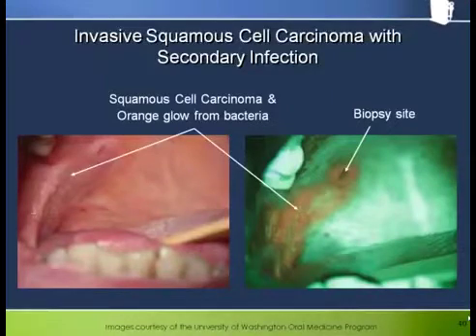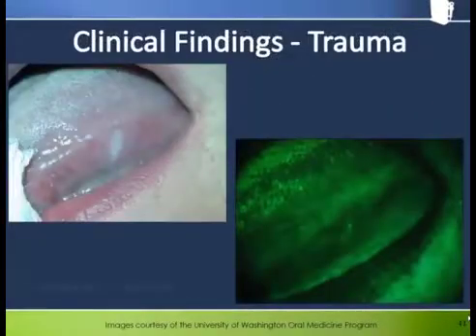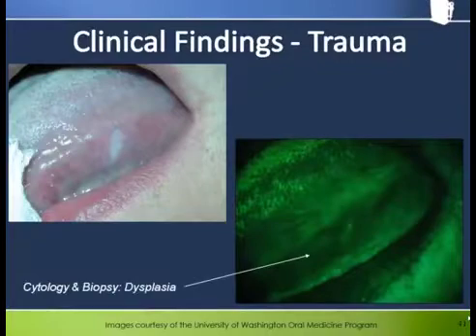Also, the fact that this squamous cell carcinoma glows bright red rather than showing a classic dark loss of fluorescence should in no sense be regarded as a sign that all is well. Hopefully, you've seen enough to understand that this is simply the wrong way of trying to use the VELscope. There can be no doubt that the presentation under VELscope is highly abnormal and warrants immediate biopsy.